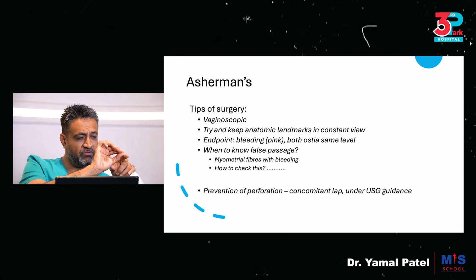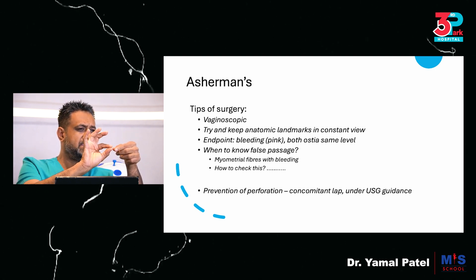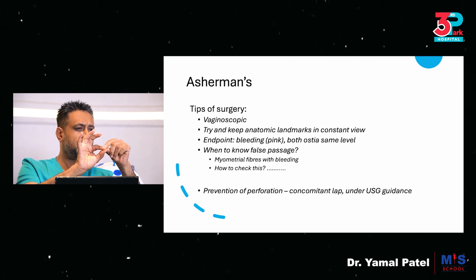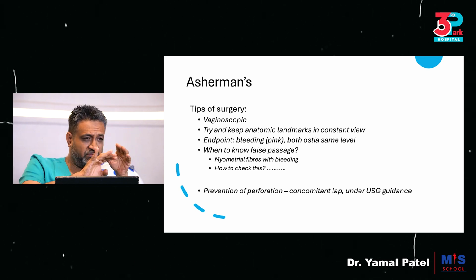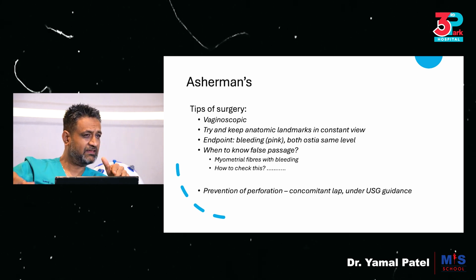When you're going on, if you want to assess with the hysteroscope, just close the channel of the inflow. If you close the channel of the inflow, the pressure within the cavity drops because you've stopped the fluid going in, and the outflow is still open.